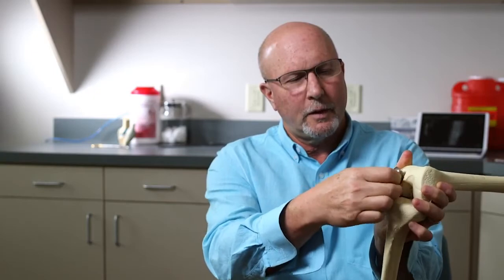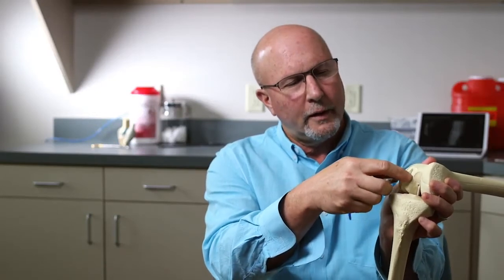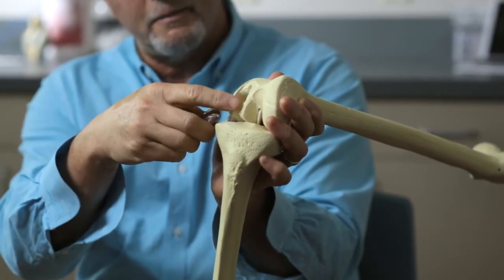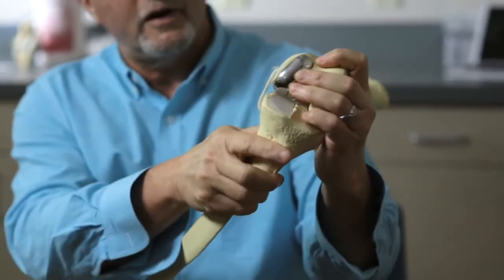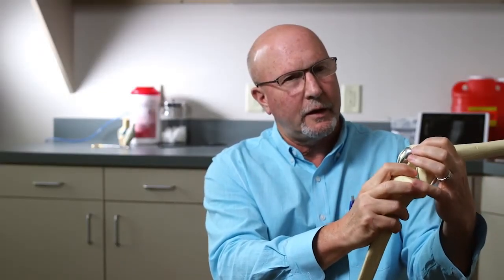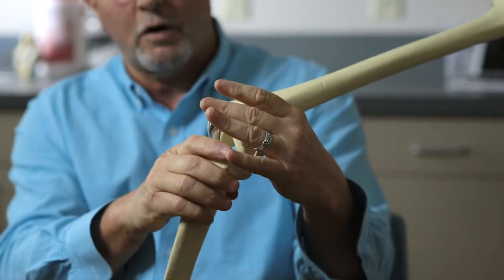Up on top, we use a smaller piece of metal, reinforced, only 2 millimeters thick. I make a hole and a slot and sculpt the rounded surface at the bottom so that this fits almost like patching the knee and putting a new surface on, removing very little bone, so that the bad side of the knee is now resurfaced, the ligaments in the middle of the knee are still intact, and all the other 2/3 of the knee is still functioning perfectly natural with good cartilage.